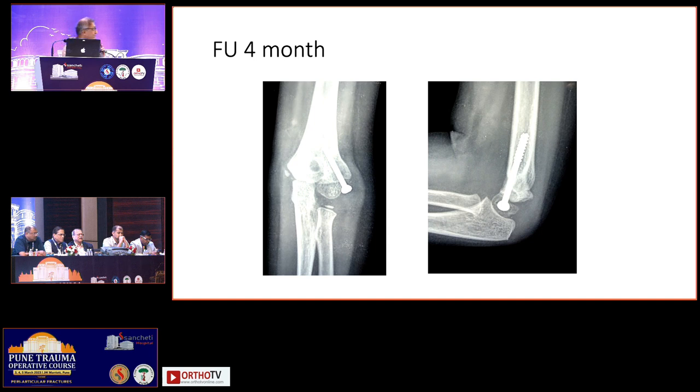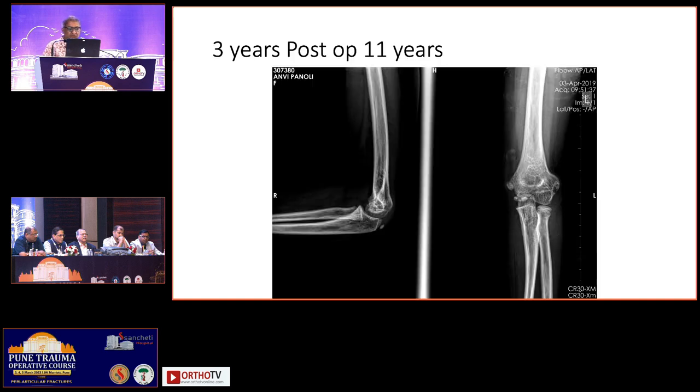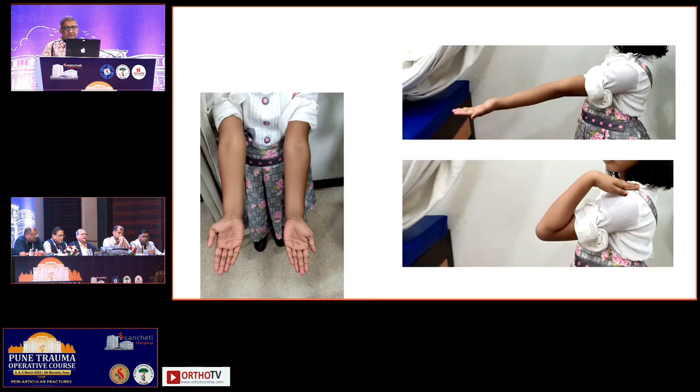What you see here is something very important. You will always see this lateral bump, which will make the parents unhappy. You have to warn the parents that this lateral bump would be there. When you take out the screw, you have a choice to remove that lateral bump, so that cosmetically also the elbow appears good. So this is at 3 years follow-up, she's doing well.